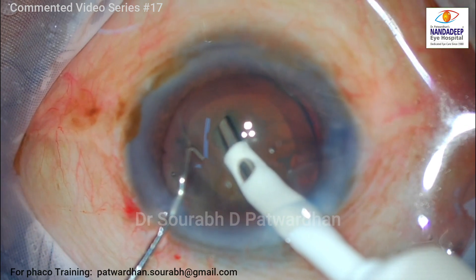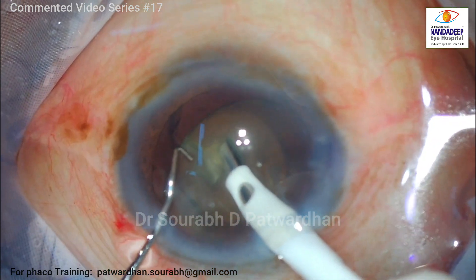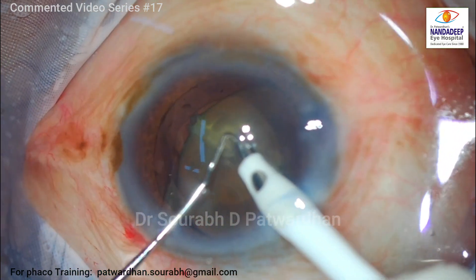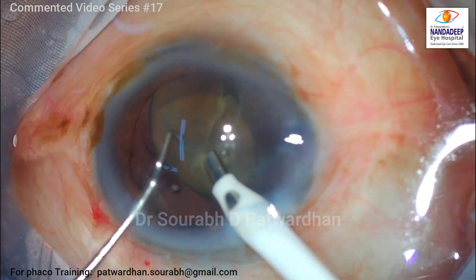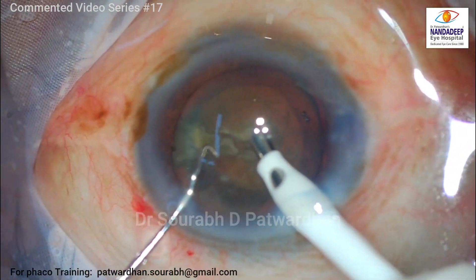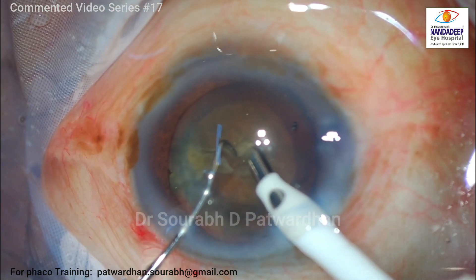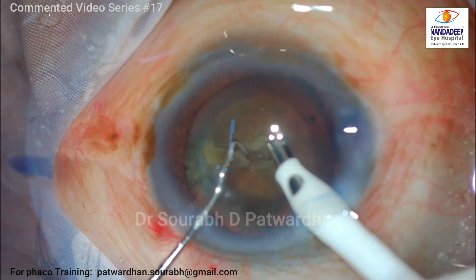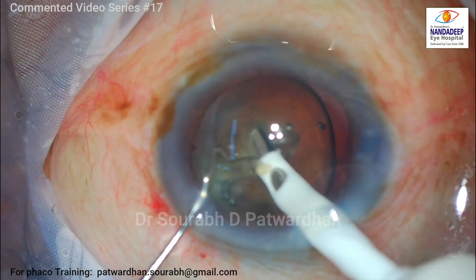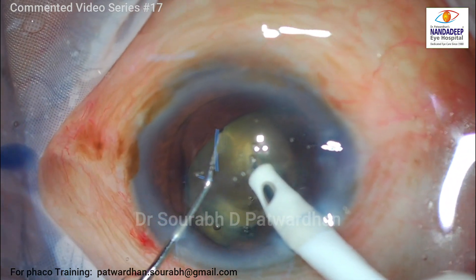You can see the nucleus is very mobile. I am trying to chop but the hold is obviously not that good, so that is not a good maneuver to attempt when the hold is not there. After talking with the technician, from my experience so far I decided to increase the vacuum a little bit and also increase the power. The phaco power was shifted to Hyperburst mode. I will show you the settings now.